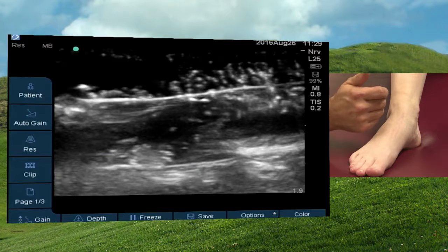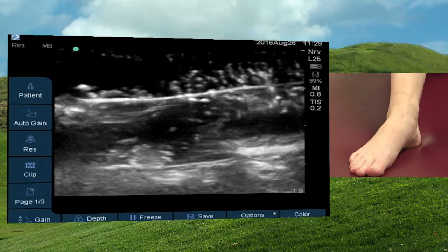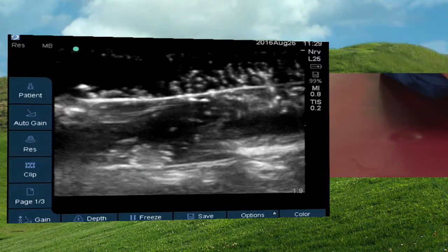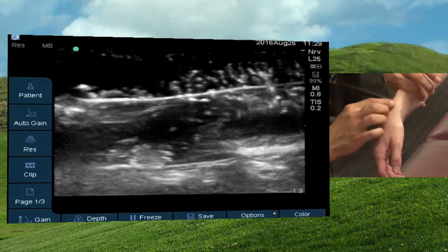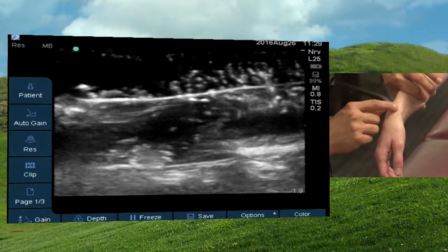When we do peds upstairs, I have a very low threshold to use this particular vein. I think it's wonderful. I also like to use a great one here, just on the lateral aspect of the head of the radius.